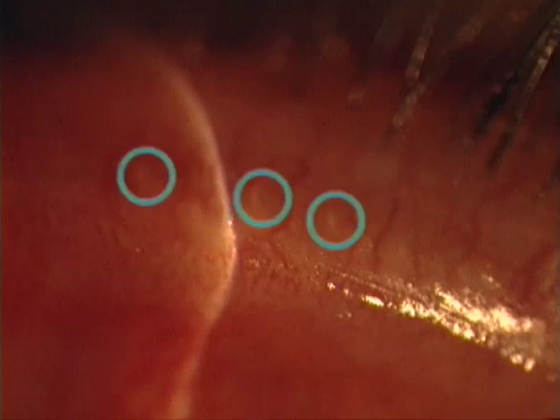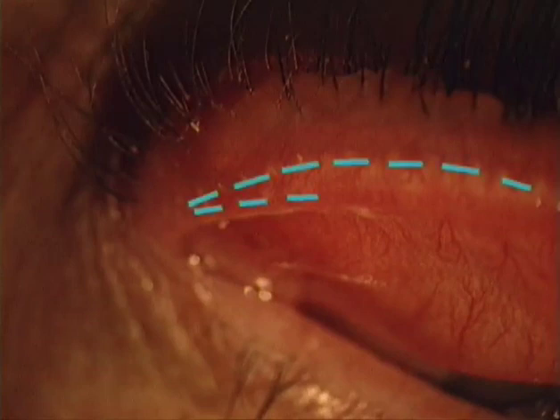These may be single ectopies, such as this single gland, seen here beside the slit light, which stands closer to the inner edge than the other glands. Or there may be multiple ectopies forming a double row. These are seen here very distinctly owing to a slight inflammatory reaction at the orifices.